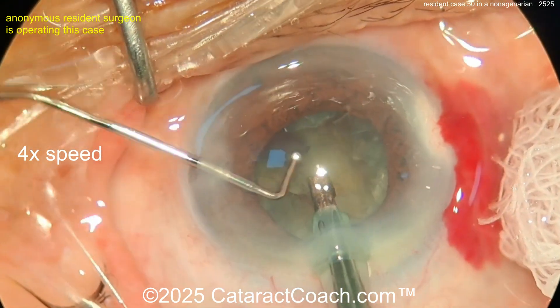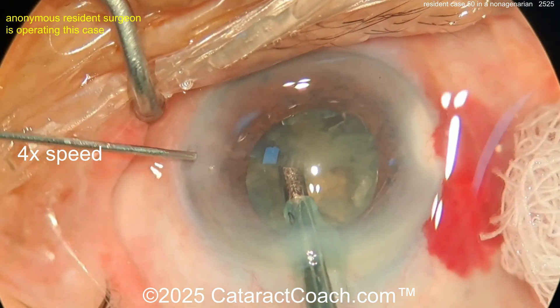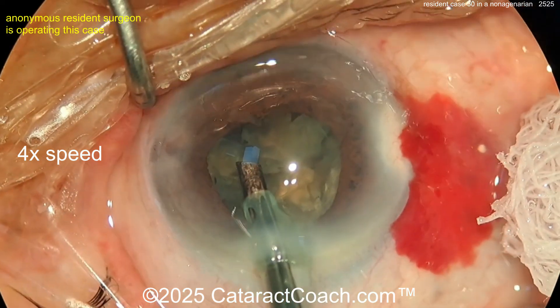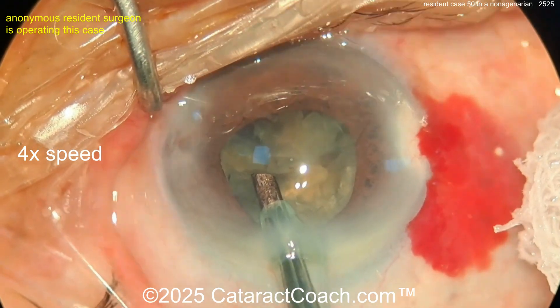Getting these pieces out nice and neat. That is a huge chopper — in fact it looks like a muscle hook to me, it's just too long. More viscoelastic is good to protect the corneal endothelium — I like that. There's that mega chopper again.